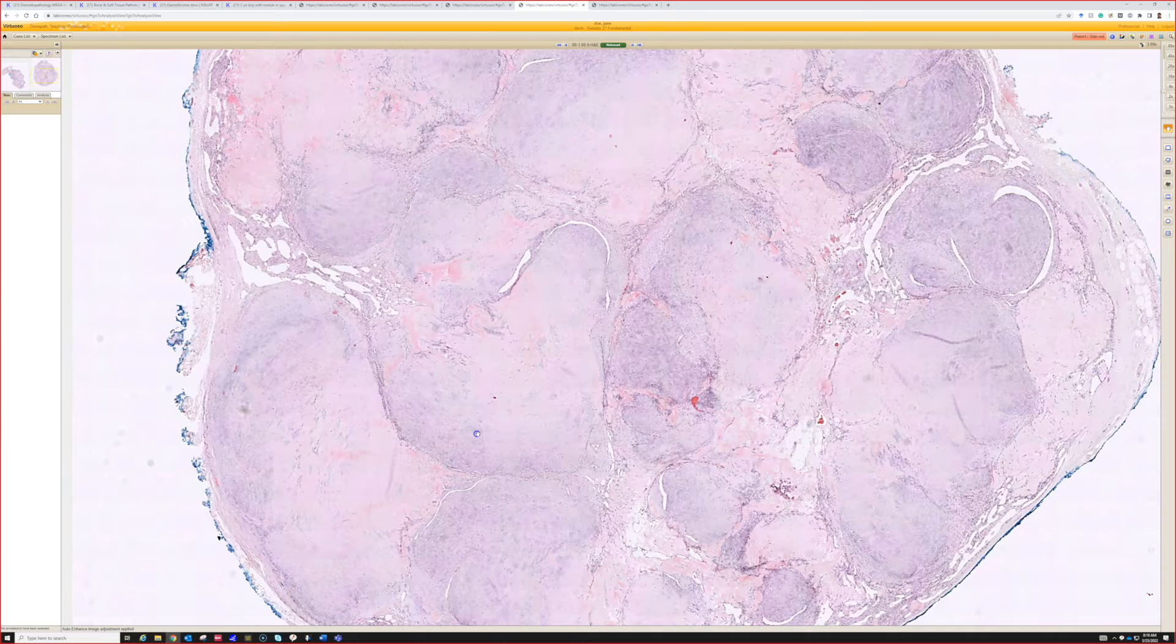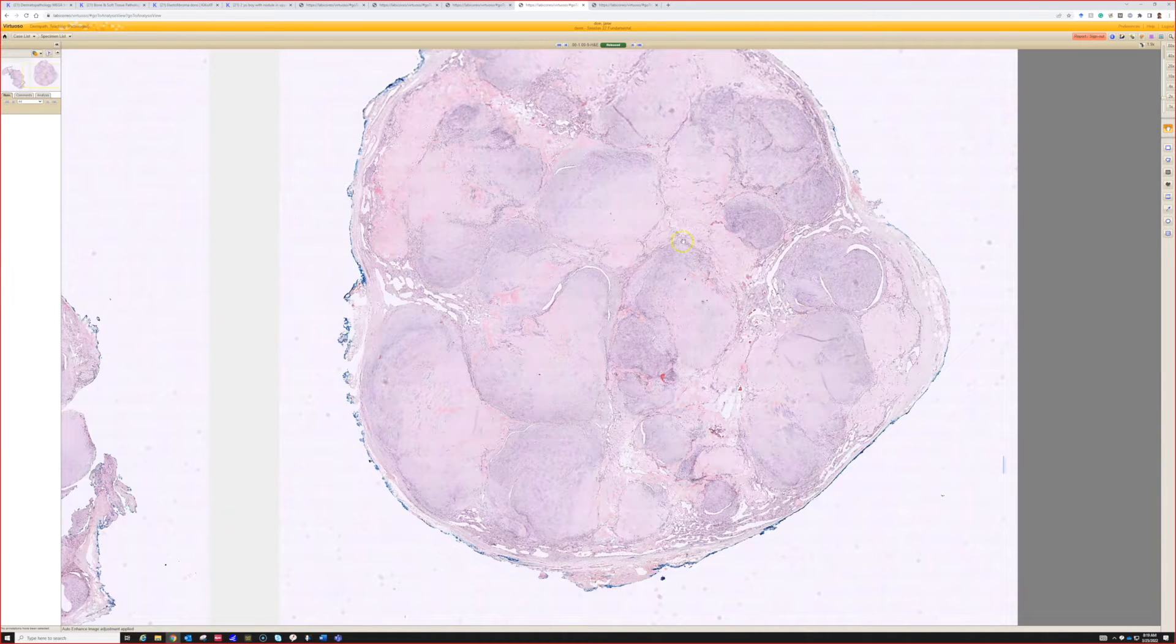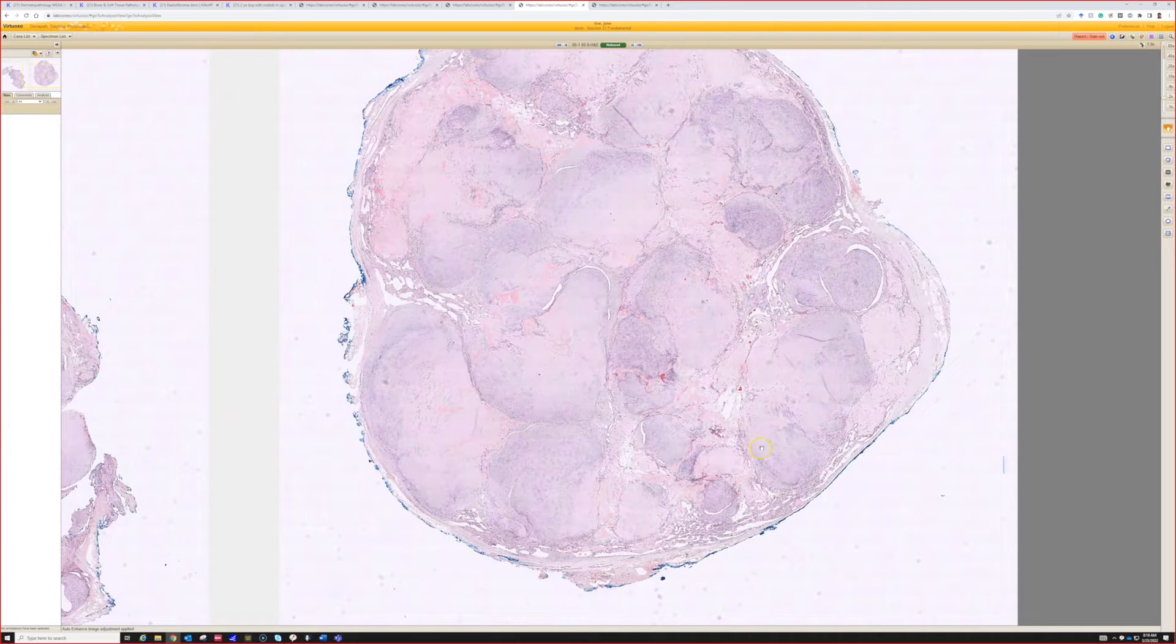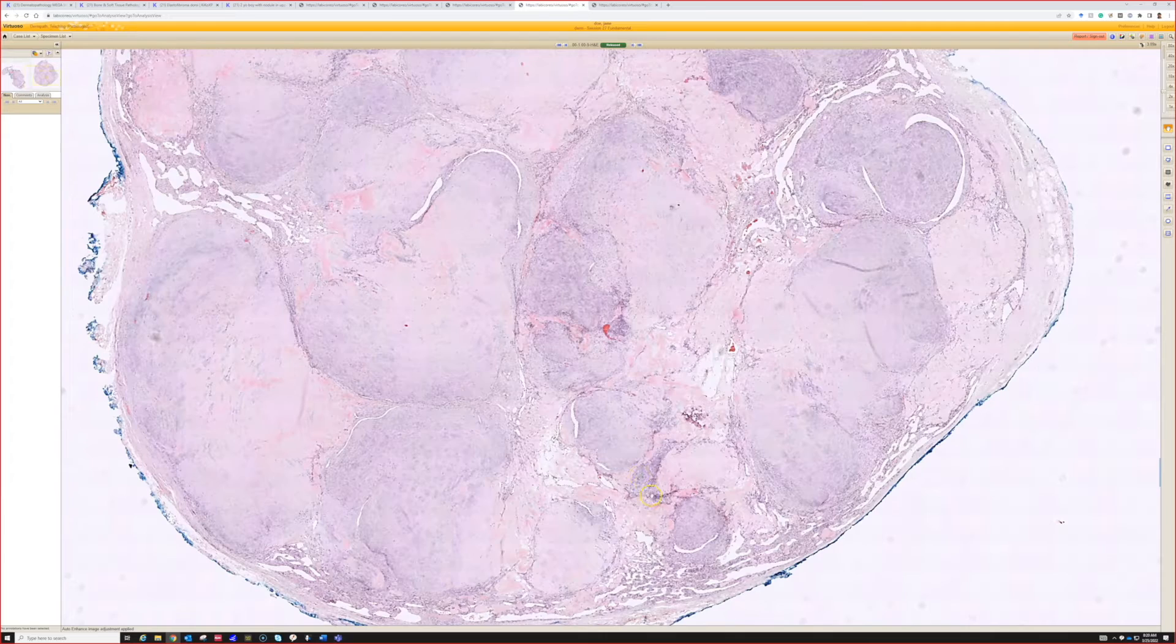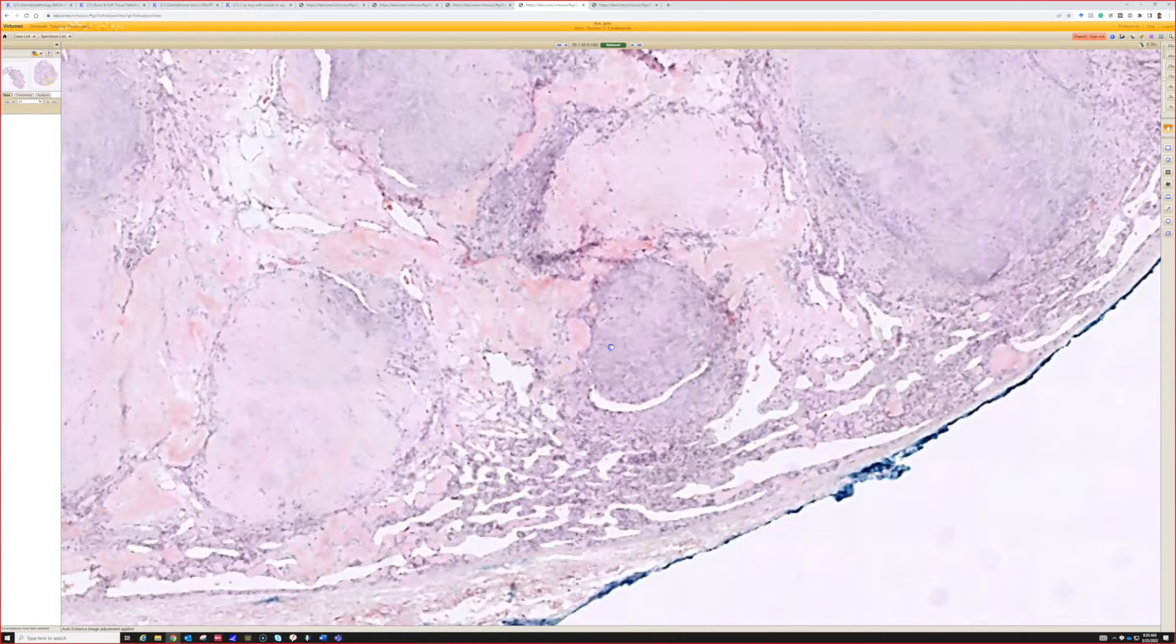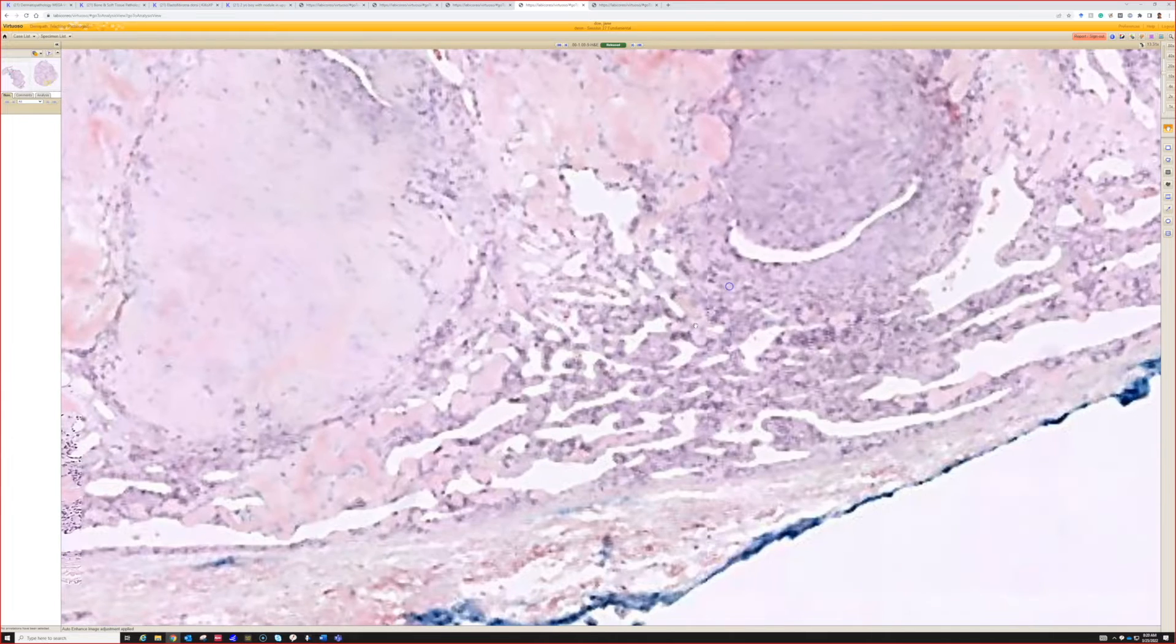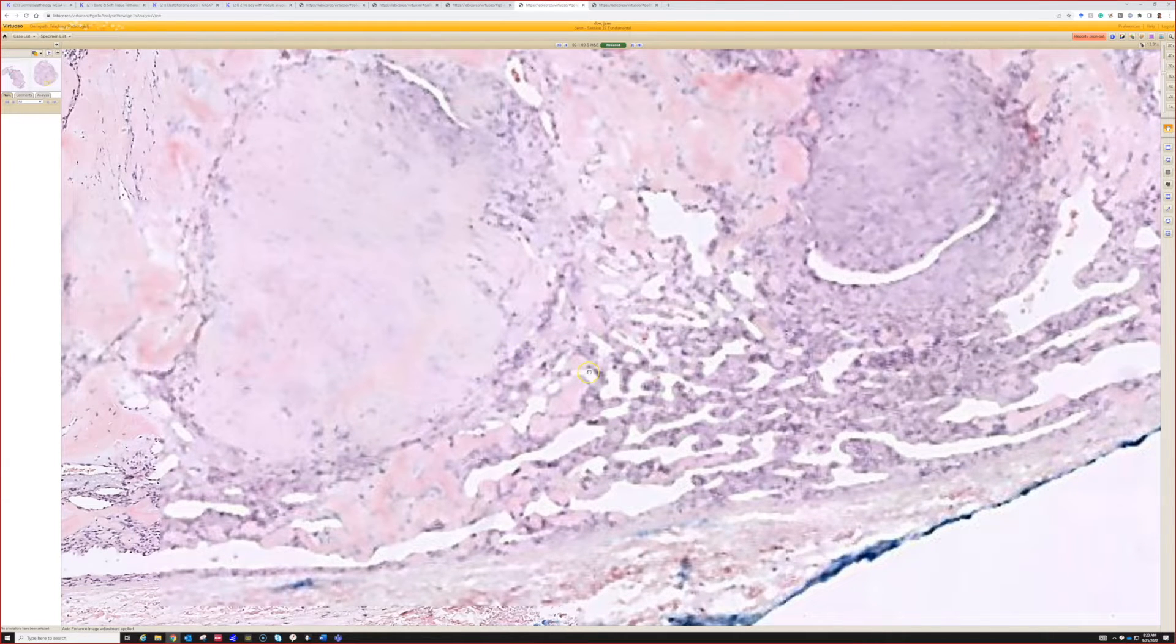Definitely multi-nodular - it's a big nodule with multiple smaller nodules packed together. And like you said, biphasic: we've got these nodules in one part, and then in between there's some other stuff which we can look at closer.